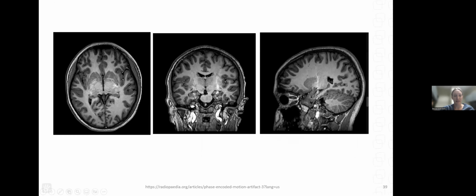So this is another example of that phase encoded motion artifact. Here on the left-hand side, this is a still of that axial. You see these hyperintensities and a very abnormal looking deep structures. And you see it here again on that coronal. But now you can better appreciate that this is in line with something, right? So here you have the vessels down here, which are hyperintense, and this is like a line. And I don't know a lot of pathologies that cause lines like that. And this is actually a ghost of the internal carotid, which is being projected into the brain parenchyma.